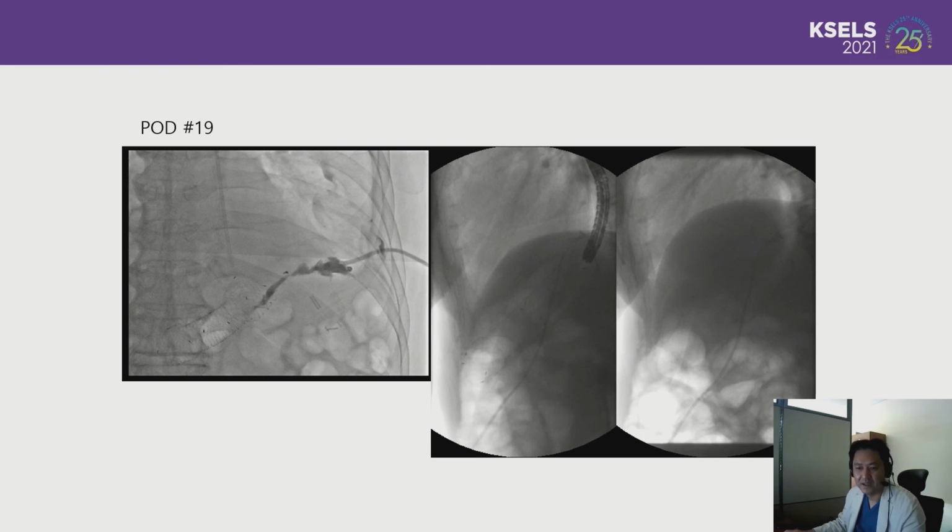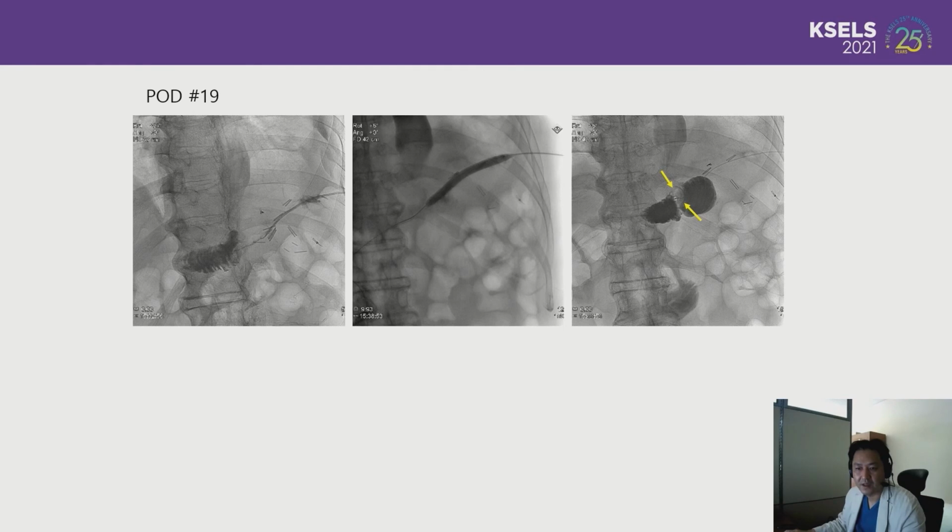Finally, we decided on percutaneous Foley catheter insertion. This tubography by an indwelling catheter shows a controlled fistula tract. Thus, the migrated stent was endoscopically removed. After tract dilatation using a balloon catheter, a 10 French Foley catheter was successfully placed.